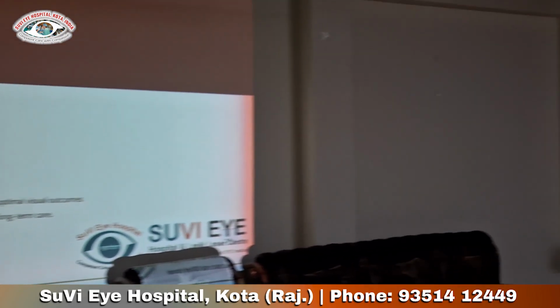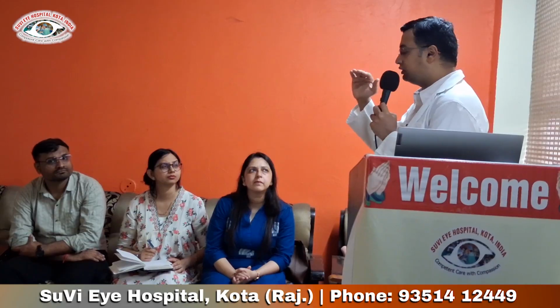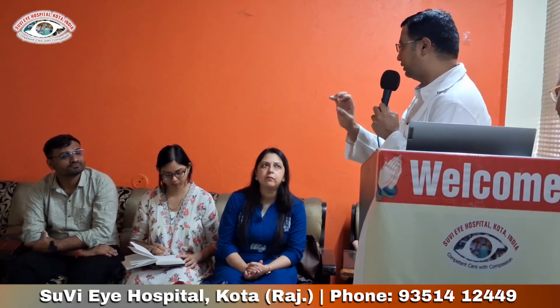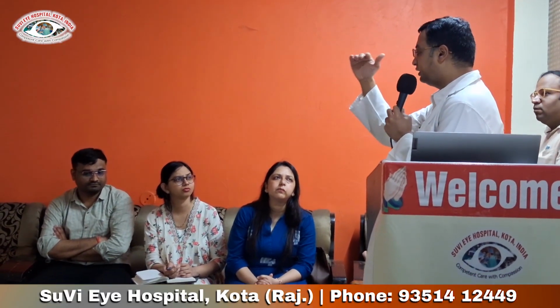So what is the difference between PRP in diabetic retinopathy and in vein occlusion, CRVO? Dr. Nipun, can you tell us? In both cases we are doing PRP, and the difference lies in one point. I will give you a hint: suppose I did a PRP on one patient of vein occlusion and one PDR patient. I did a full, complete PRP in 2-3 settings. In the diabetic patient I went till the mid periphery, and in vein occlusion the same I did.